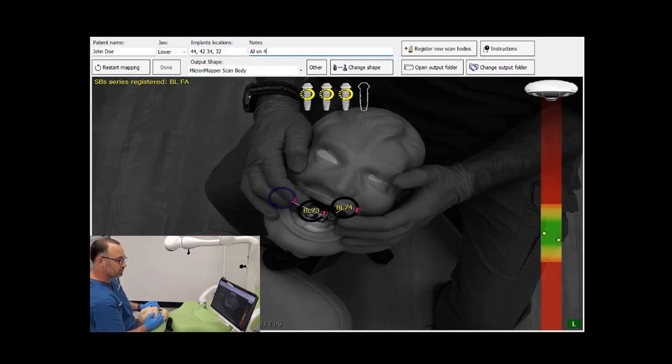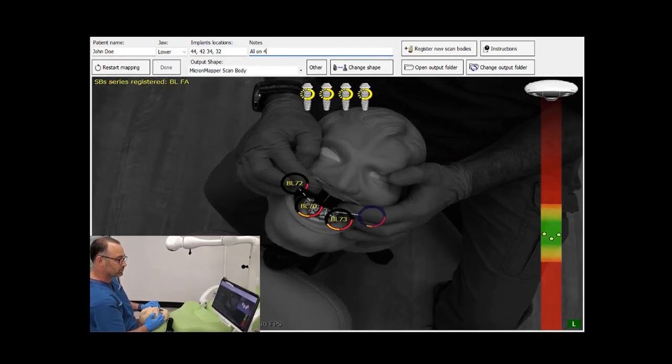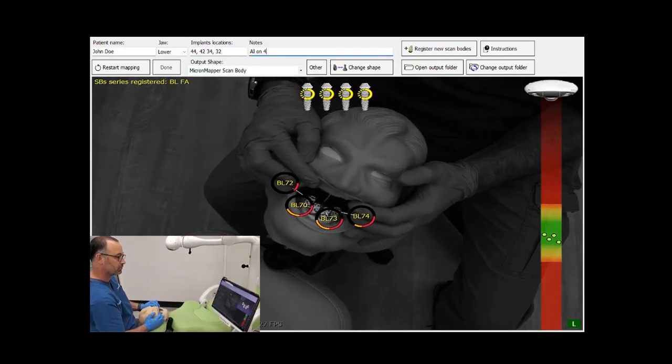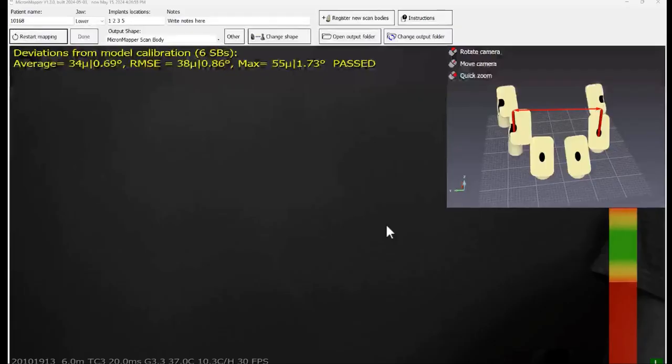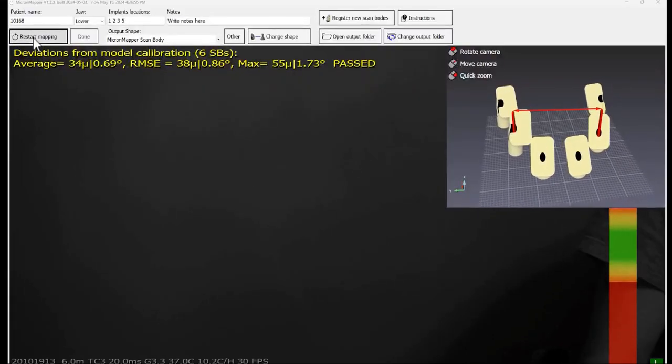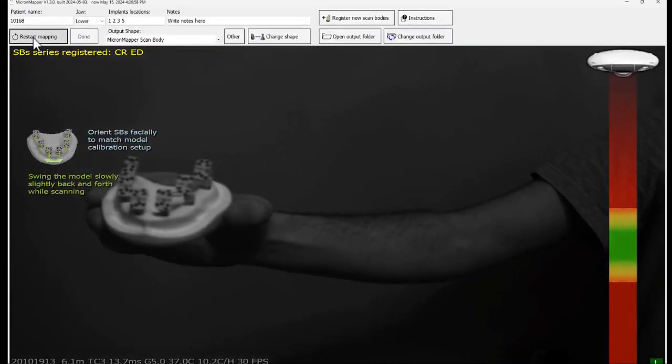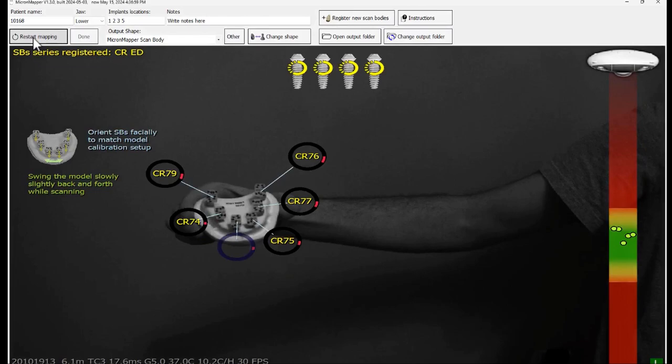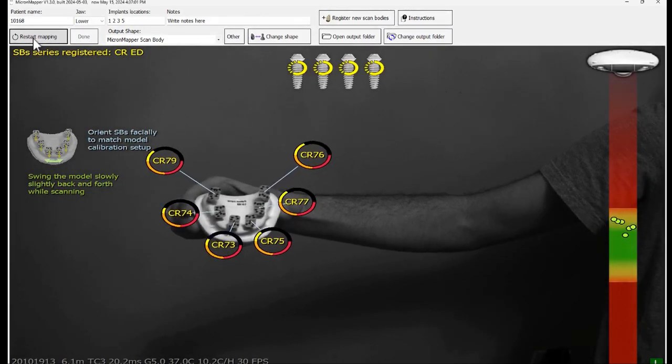In a real patient, a good lip retraction should facilitate the scanning process. Click on restart mapping. The scanning process is the same as during the accuracy test.